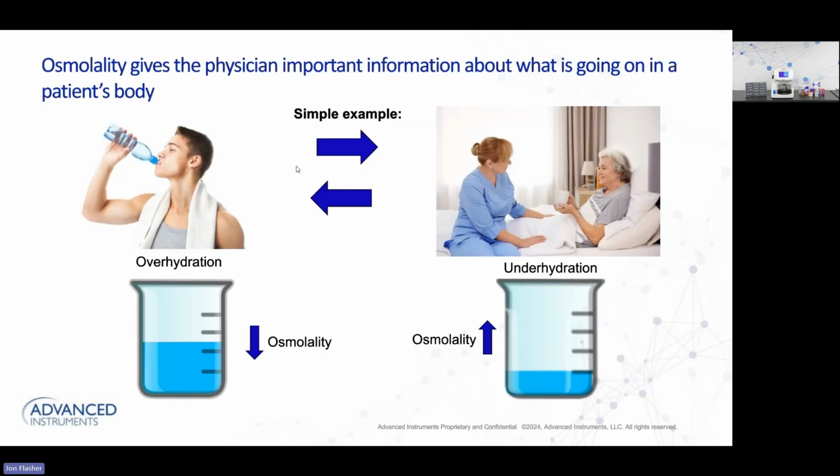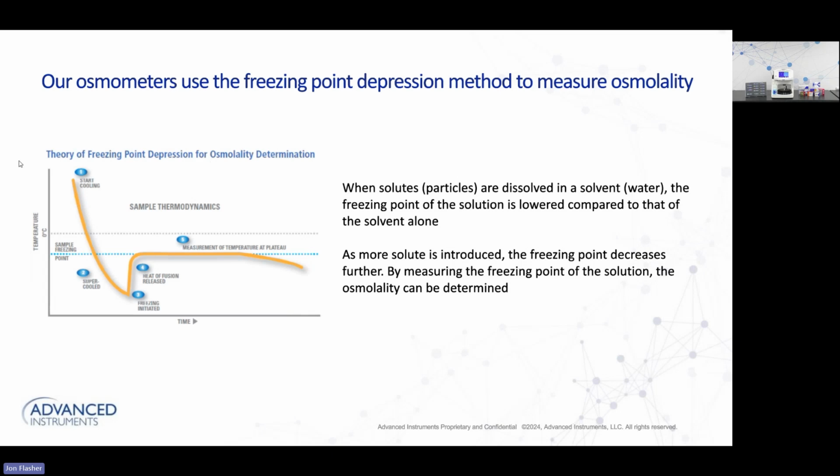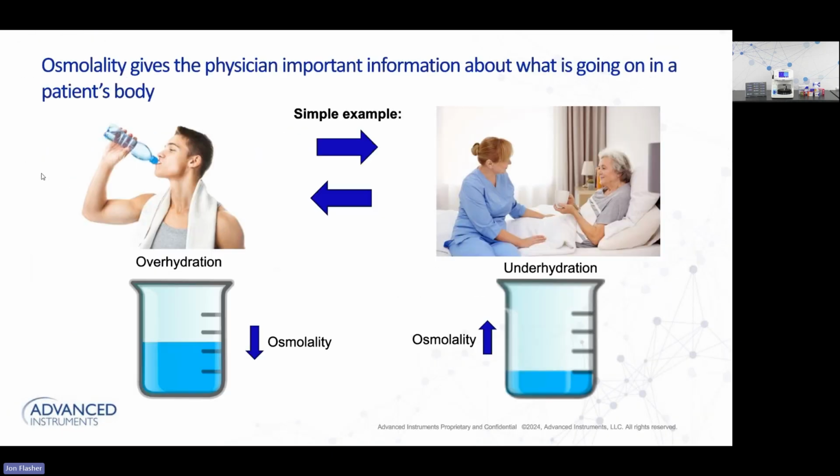So that's what osmolality is, but what is it used for? And it looks like I'm missing some graphics on this page. But one of the things that osmolality does is it gives the physician some important information about what's going on in a patient's body.